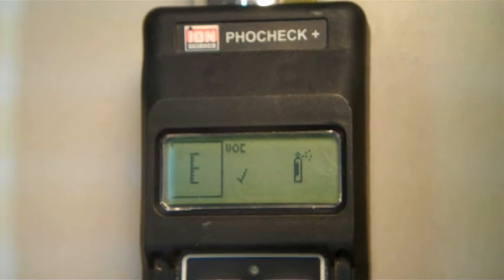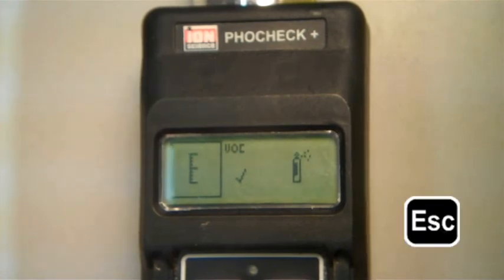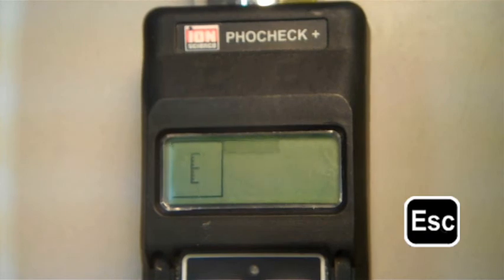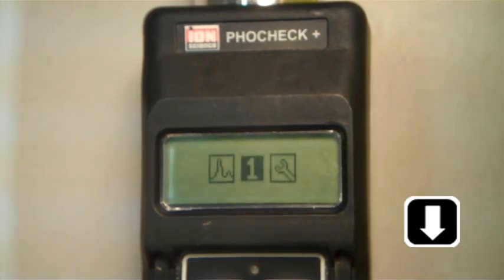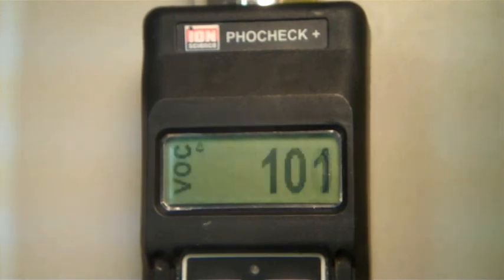Press the escape button until you see the main menu. Then scroll to the number one icon and press enter. This is the main reading screen. You should notice that the unit is reading a concentration of 100 ppm, or at least within 5% of 100 ppm. After a moment, remove the bag and confirm that the readings fall to an acceptable range close to zero.